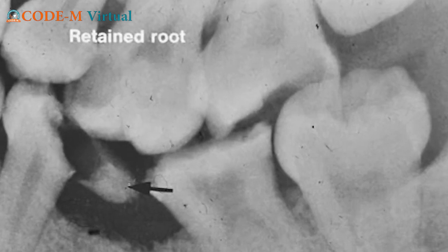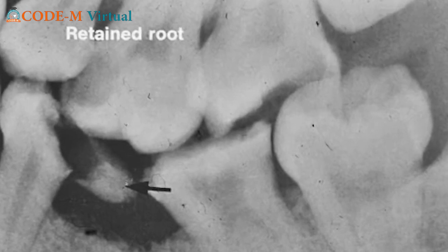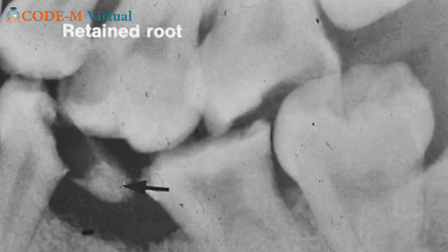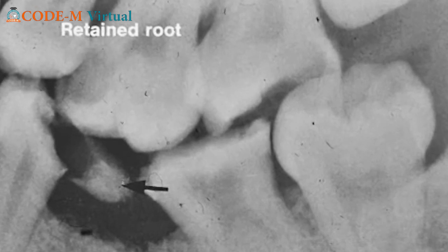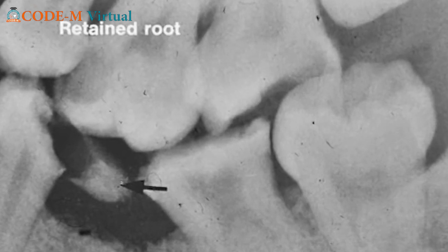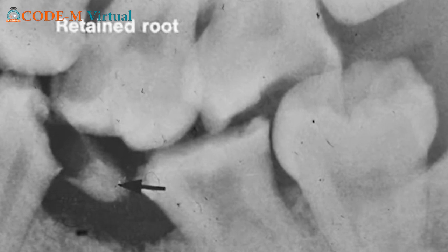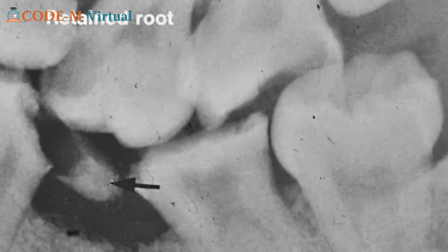And we can see that the upper tooth, because of this missing tooth, has over erupted or super erupted. As we know, mostly wherever the tooth is missing, the upper teeth try to take that position and try to adjust the occlusion.